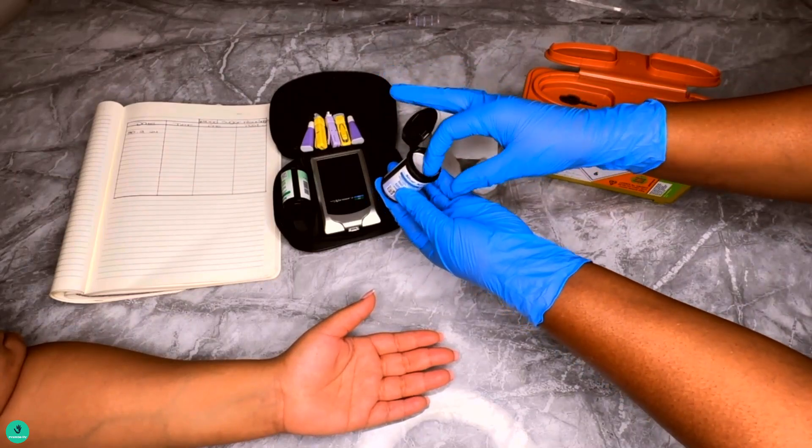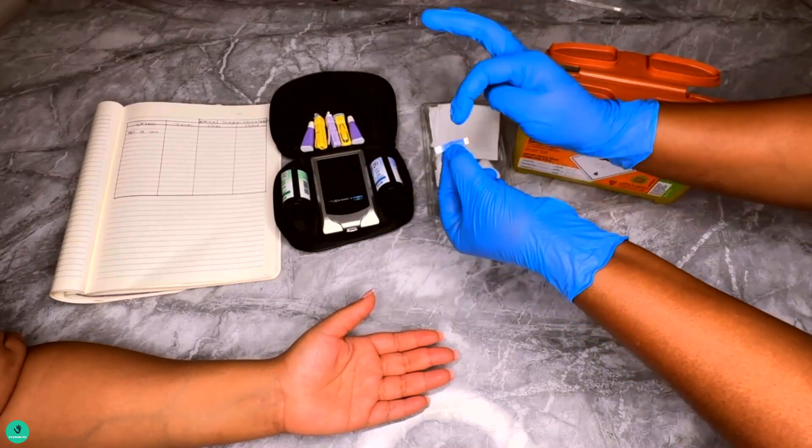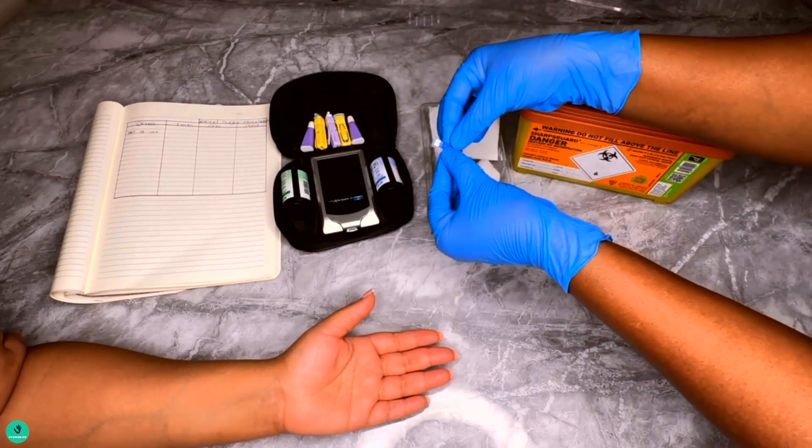Number three: ensure that the finger pricking device has been loaded with a new lancet. Number four: put a test strip into your meter.